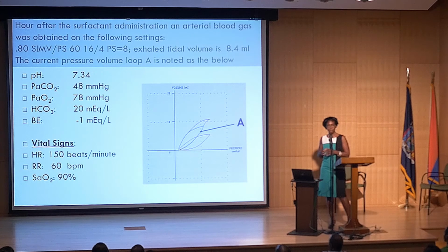when it comes to pressure support, just remember one thing: how on your mechanical ventilator that you're working with, when you set that pressure support, is it above the PEEP, or the number that you set in, is that the actual pressure support that that person is receiving? So this is whether you're working with a neonate, pediatric, or an adult patient. Because some ventilators, most of them nowadays, the pressure support is above the PEEP.